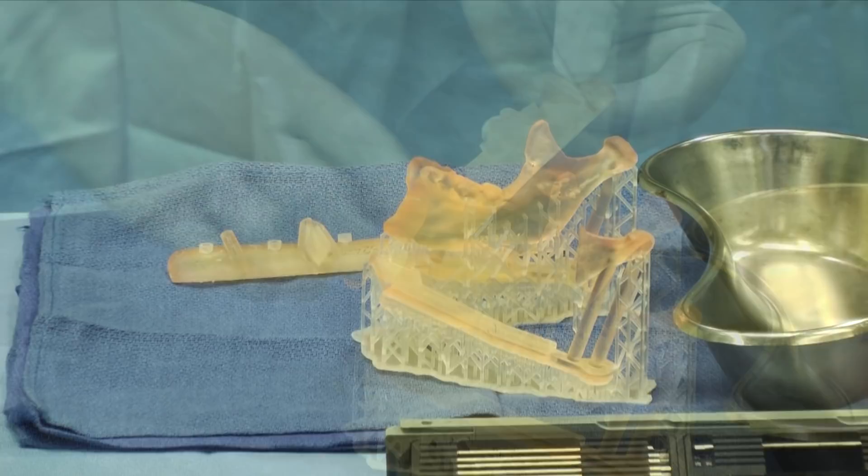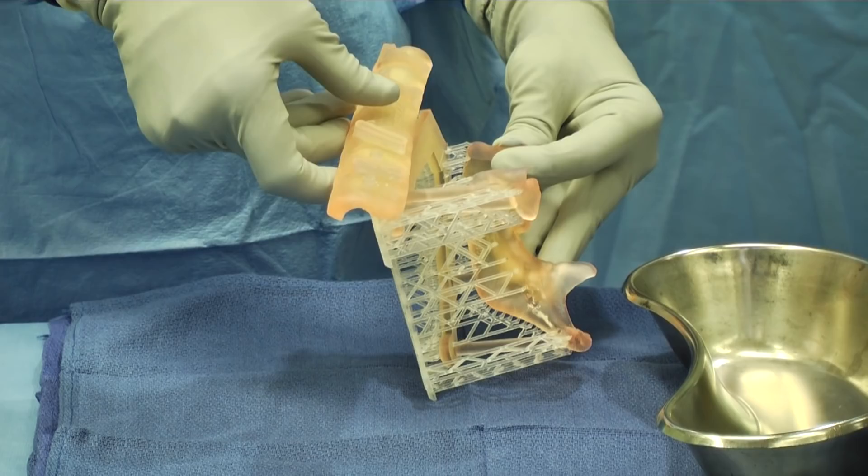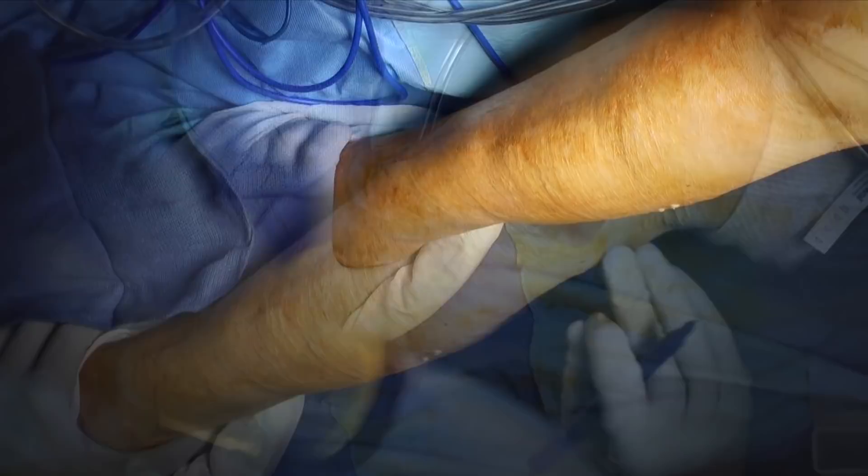The use of cutting guides for the mandible is not absolutely necessary, but for more complex defects, the ability to 3D model the defect, use cutting guides to plan the reconstruction, and use models to perfect the reconstruction are highly valuable. In this situation, we have a patient with a lateral mandible defect in several segments that's going to be reconstructed.